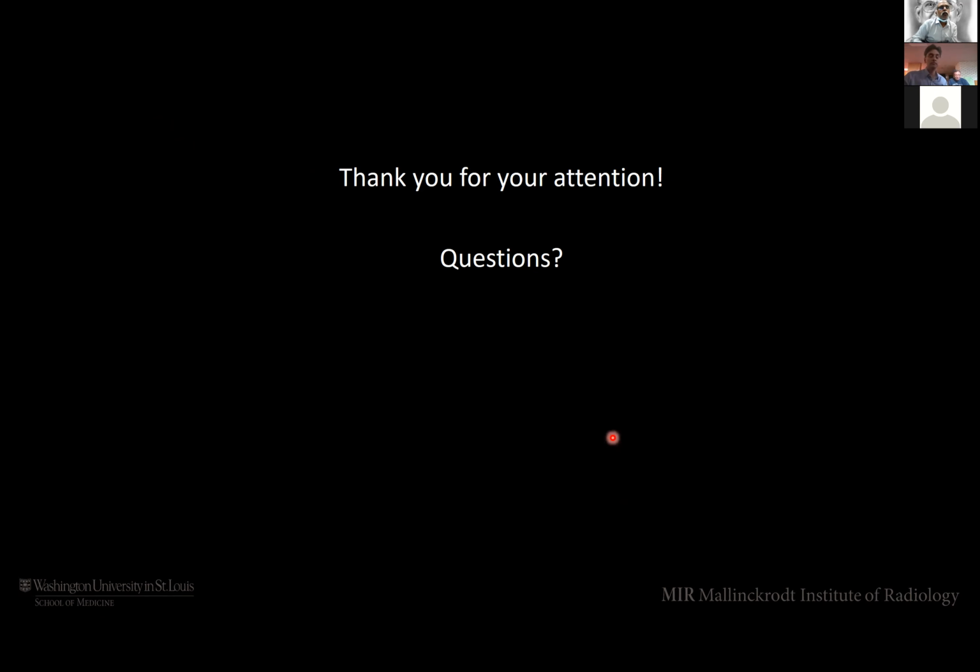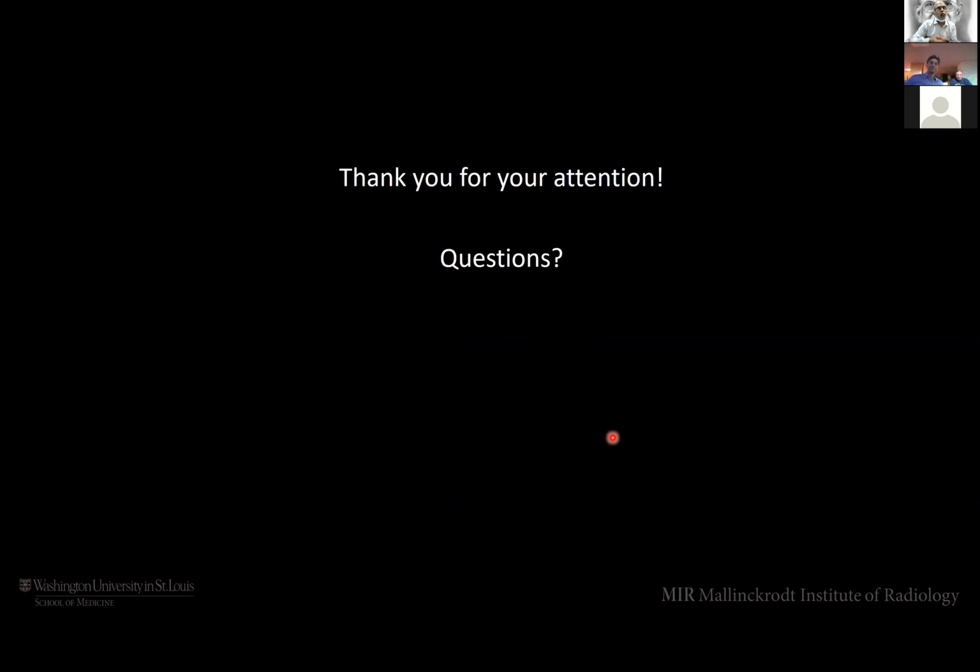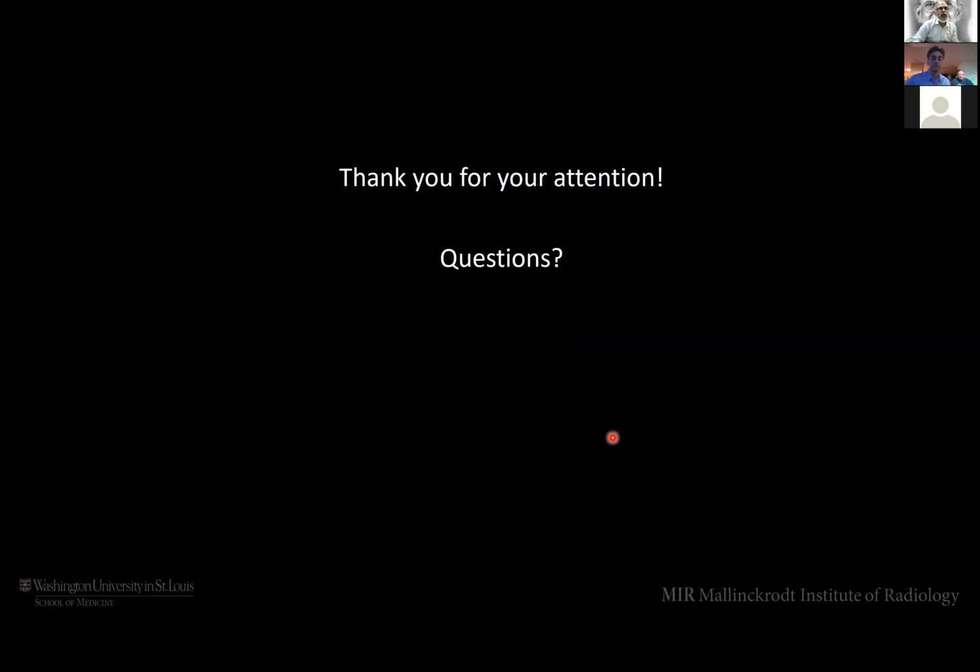Thank you very much, Vamsi. That was a very enlightening lecture about non-HCC lesions. Like I told you before, everything is HCC or otherwise. So this is what is expected to be learned by the radiologists who are reporting livers regularly. So that was a very nice presentation, and it was a very systematic, practical, algorithmic approach for the students. I hope whoever goes through this lecture will benefit in their future reporting patterns.